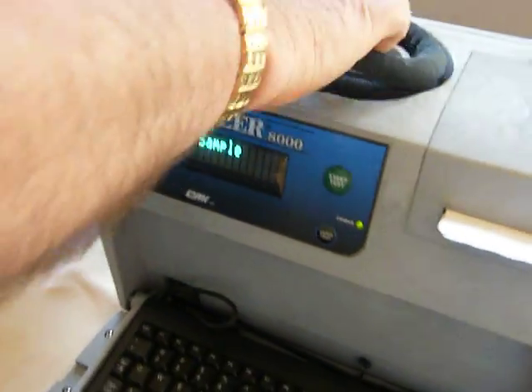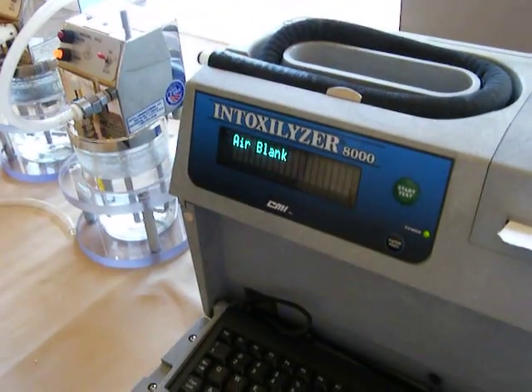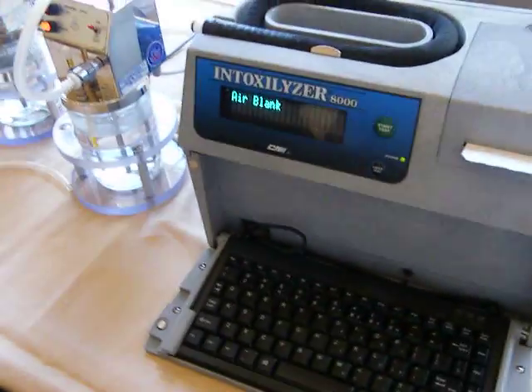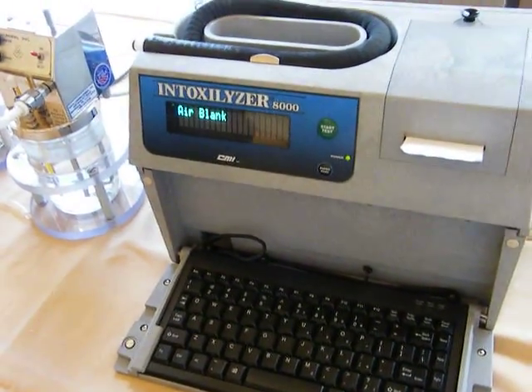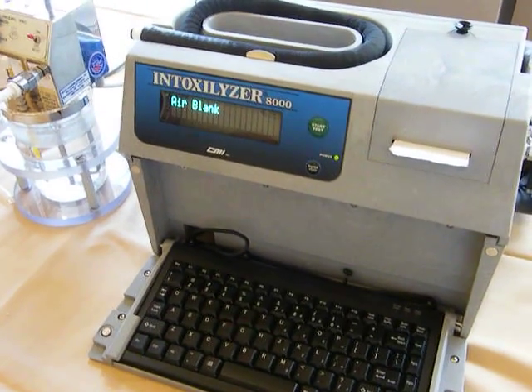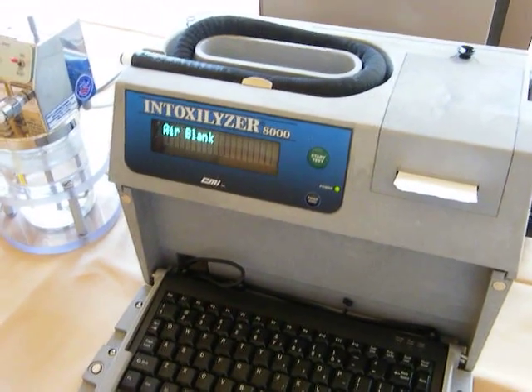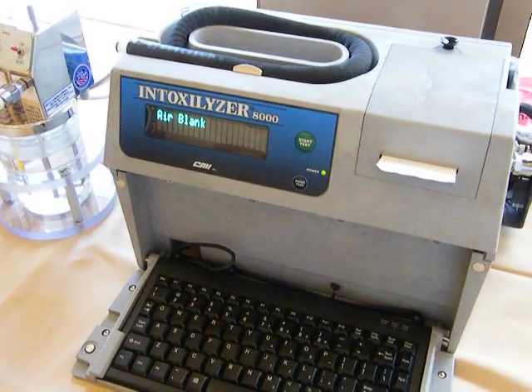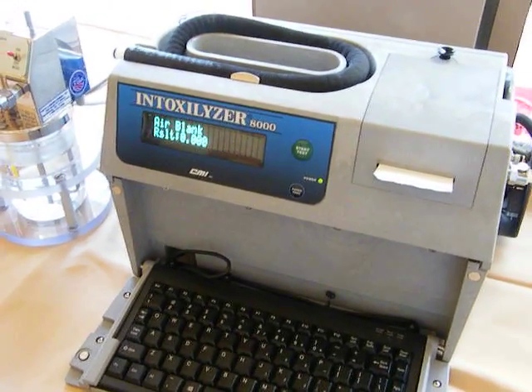He got an invalid sample. Oh my God, you got a valid sample with Fred. We'll do it again. He's eating it. He's going to have to go through the prompts. Charles, were you just blowing hard? No, I was just blowing regular. I was trying to get a reading — trying to get like a .009 reading. Next time I'll blow it hard.